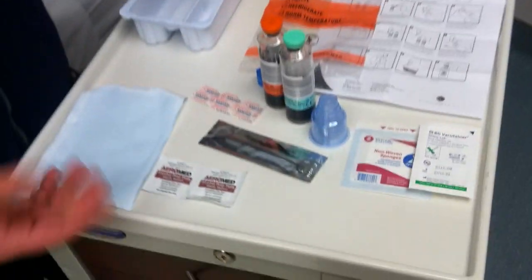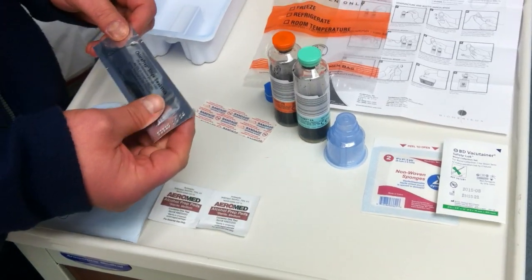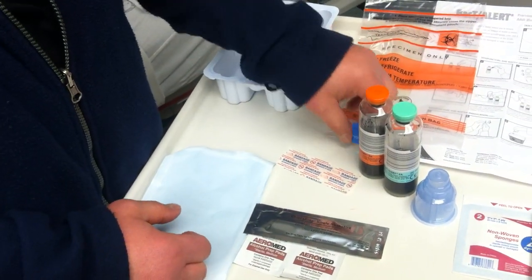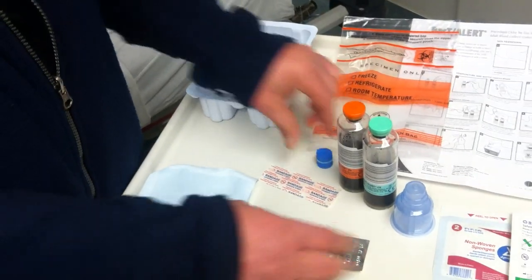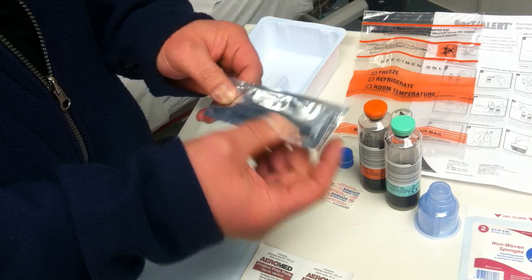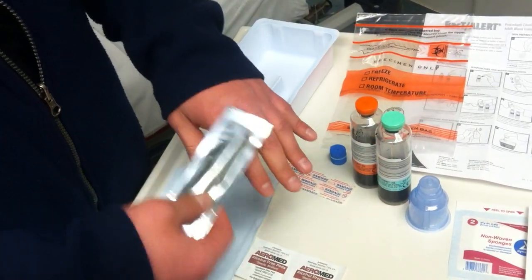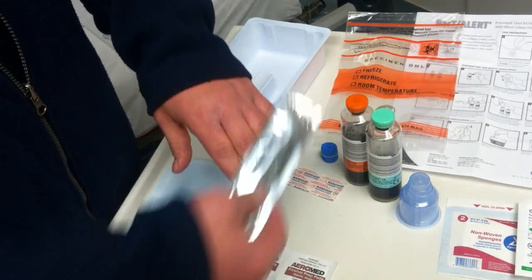As with all blood draws, we want to assess for a good vein. Hand washing is always very important. We'll have our gloves on. Assess your vein, apply your tourniquet, and then we're going to use a chloroprep stick. The chloroprep stick is just a swab, and on the arm we're going to wipe, starting from the center and swirling outward.